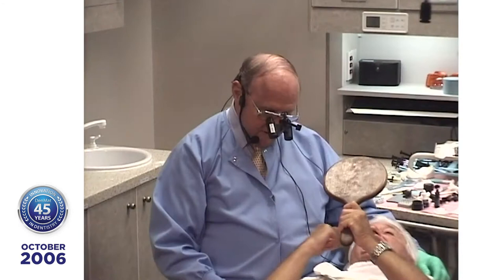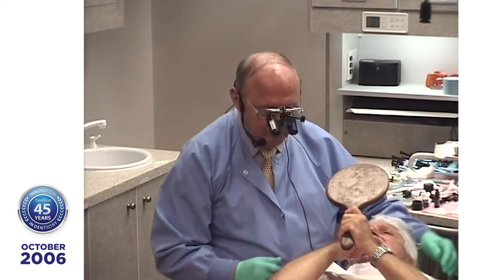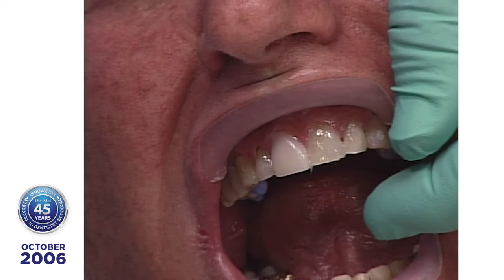The left one or the right one? Right one? I think the right one is what we picked out yesterday. We see spaces all around the margins of the porcelain. But that gets filled in with the Ultrabond.